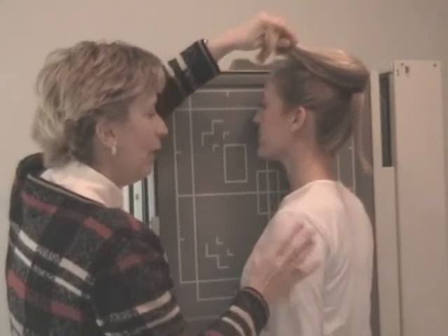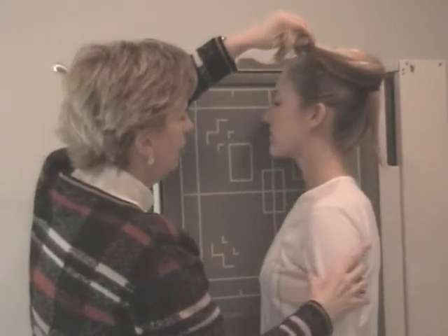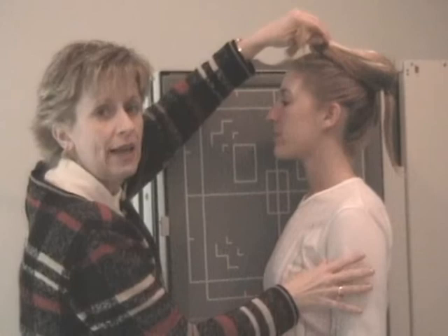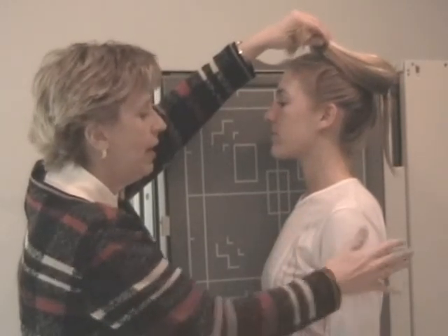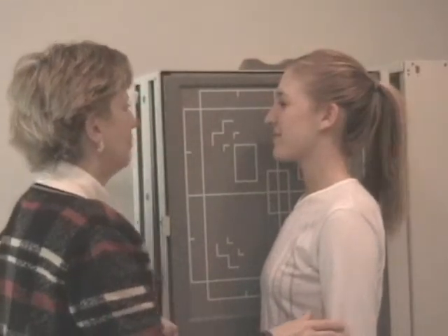Now, if the intervertebral foramina are not open and you see mostly shoulders, white over the shoulders, and the clavicles aren't laid out, and you don't see a lot of lung laid out, she was too steep, and you need to lessen the degree of obliquity. And that's the oblique. Again, do both sides. Do both obliques.